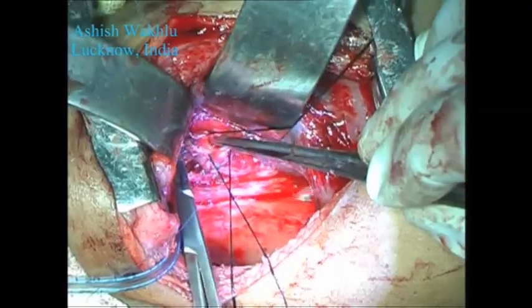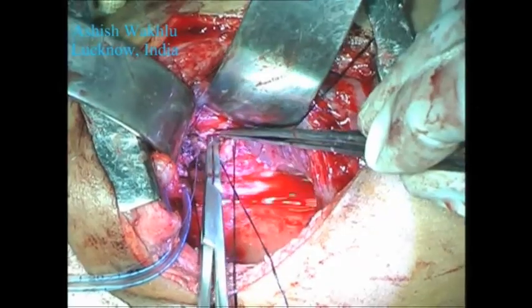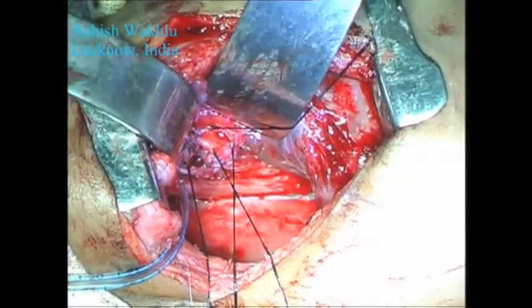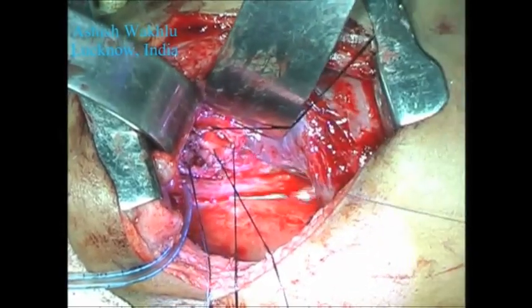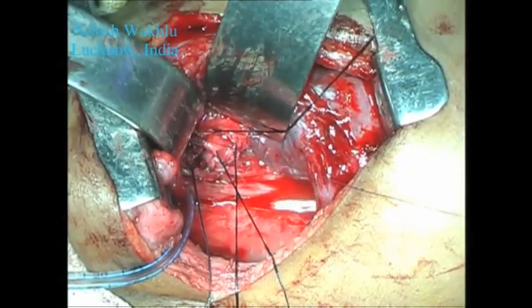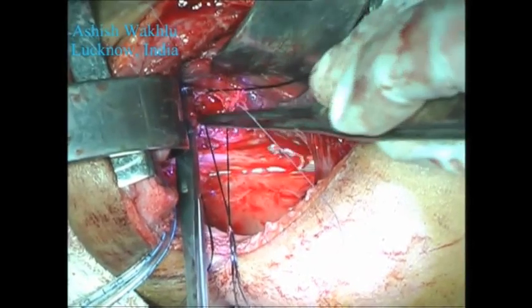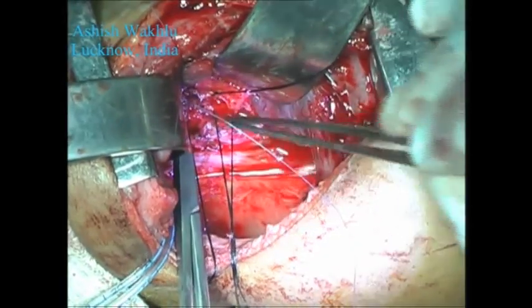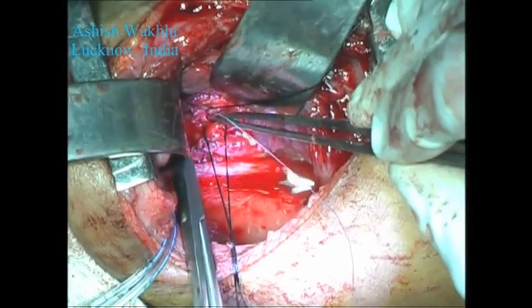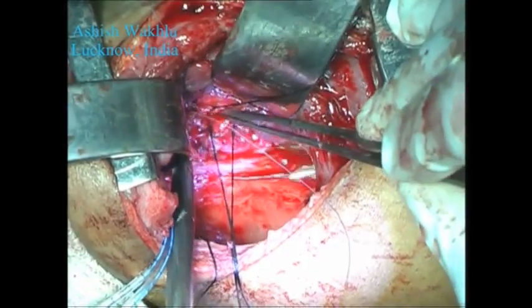So we are continuing the anastomosis, joining the posterior wall of the right main bronchus to the posterior wall of the bronchial bifurcation in the hilum of the right lung. You can see the lighter colored bronchial bifurcation coming together with the bronchial stump in the depth of the wound. It is not a very easy place to operate.